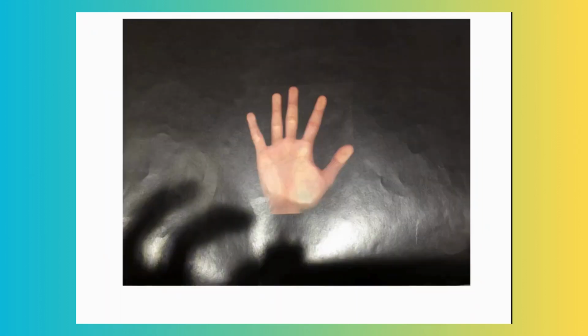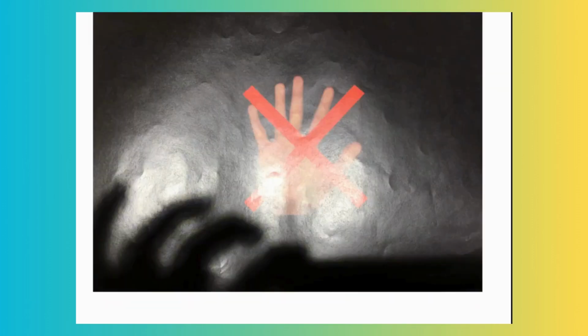That's the other thing, because we don't want to stimulate the brain other than that area. Even opening eyes with the eyelids will also stimulate the brain because the muscles are used. So here the patient will start moving the fingers and here he will stop. And we will tell the patient.